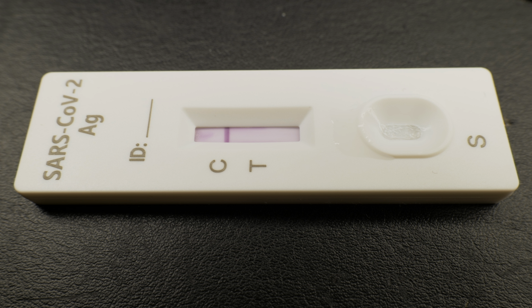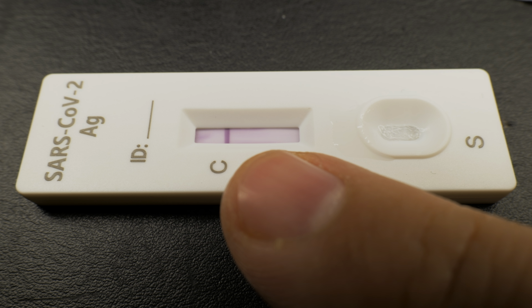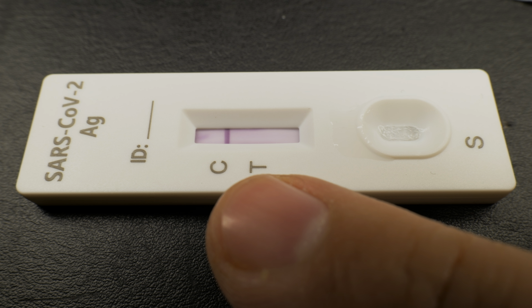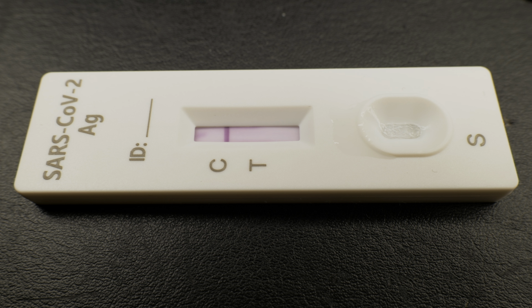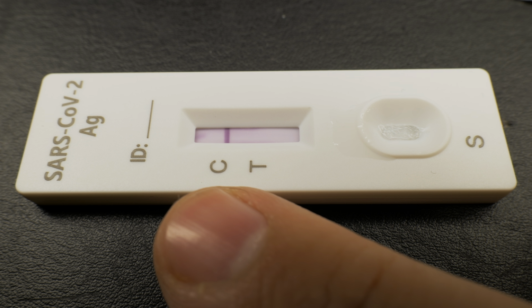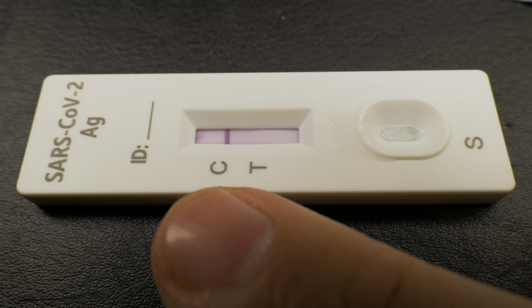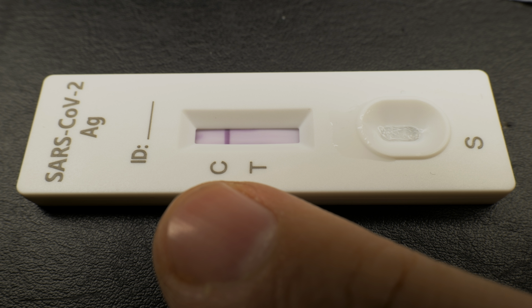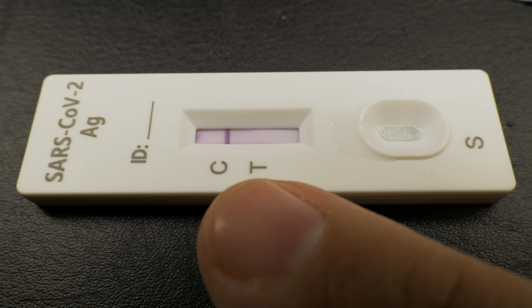You still have to wait 15 minutes to make sure nothing shows here. After 15 minutes, if there is no trace of a line on the T zone here, you're okay, it's negative. Most important is to have the one line on the C, that means the control is working, and no line here, that's negative.